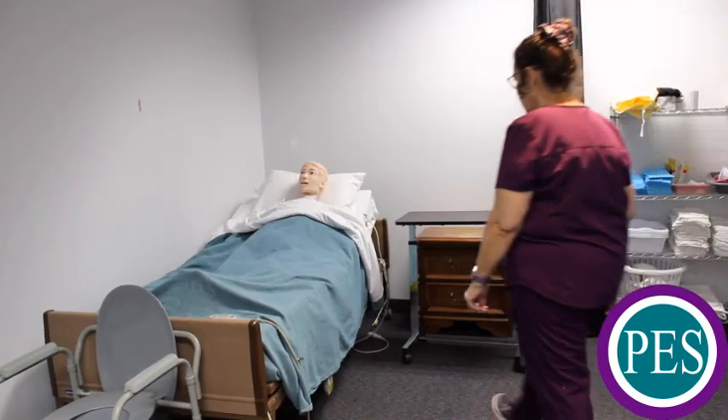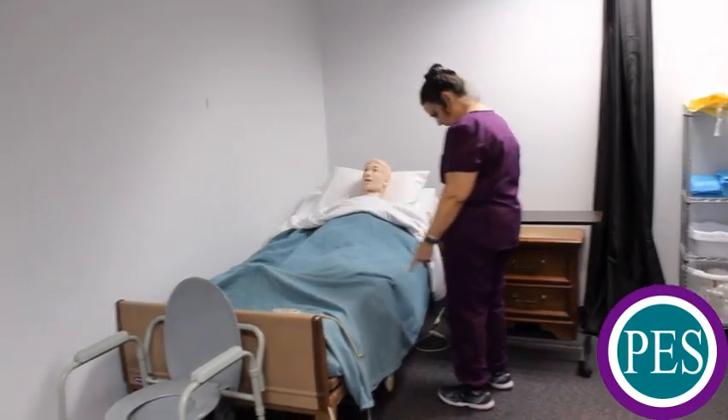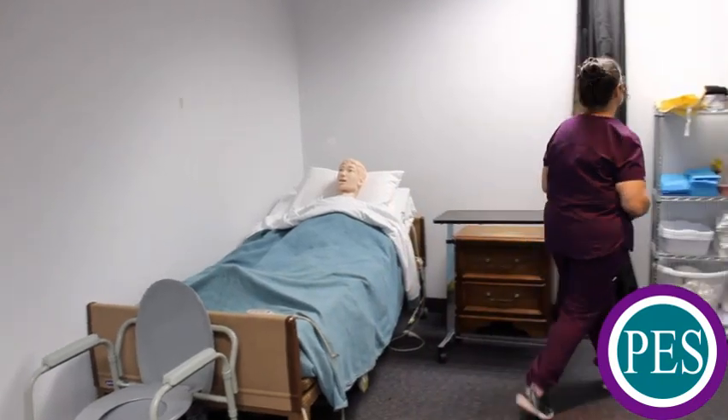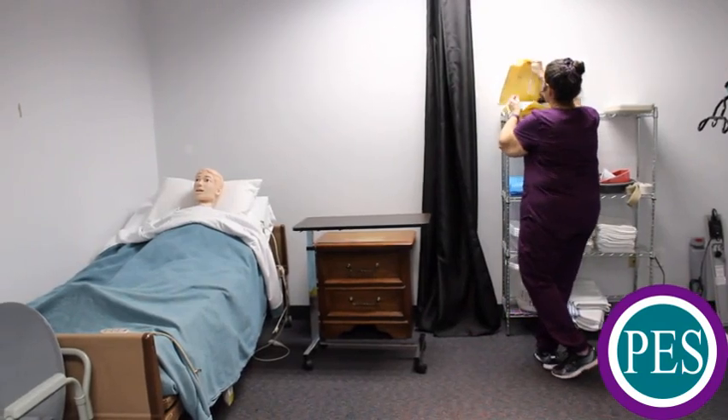Explain the procedure to your resident. Maintain respectful and courteous interpersonal interactions at all times with your resident.